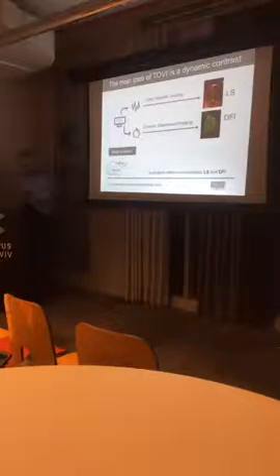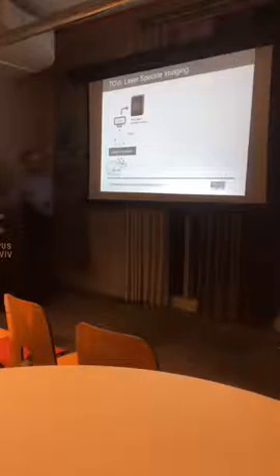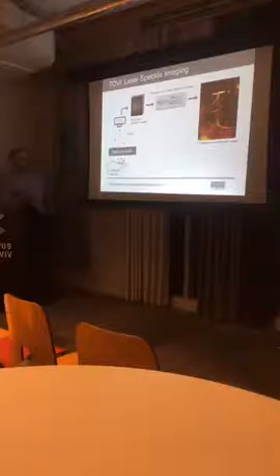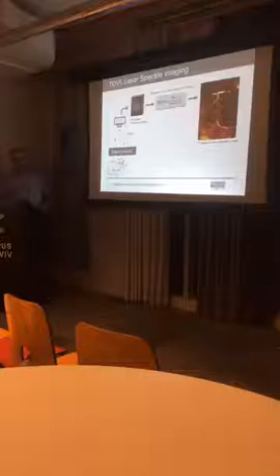Okay, now I would speak a little bit more in detail about this technique. Like I mentioned before, these are speckles. If we illuminate the cranium with a laser, we can collect the laser speckle images and use a simple mathematical formula.